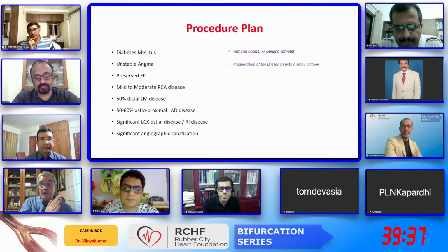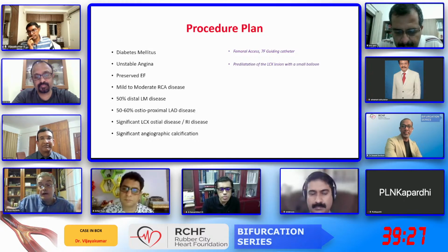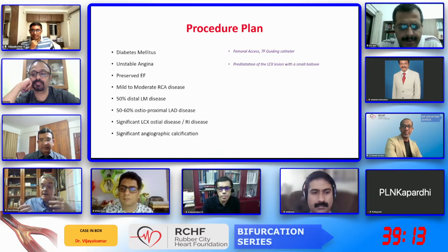But imaging to plan strategy, I think it's good. But in any case, I know there will be a second stent most probably. It doesn't make any difference. I'm not going to stop before I achieve an optimal result. Whether it's with one stent or with two stents, I don't think there is a need to discuss in advance.